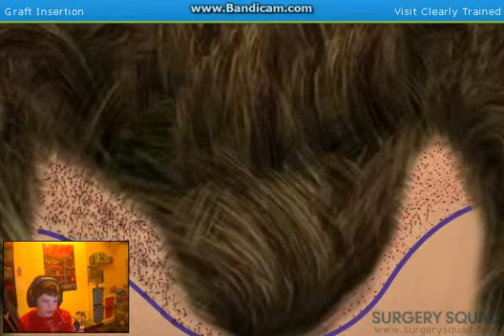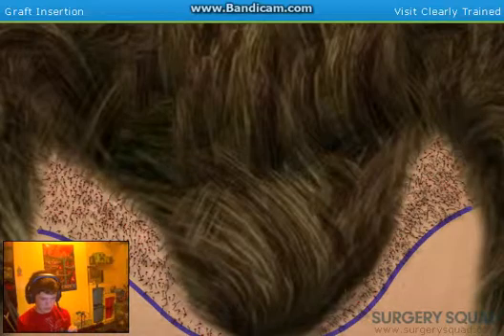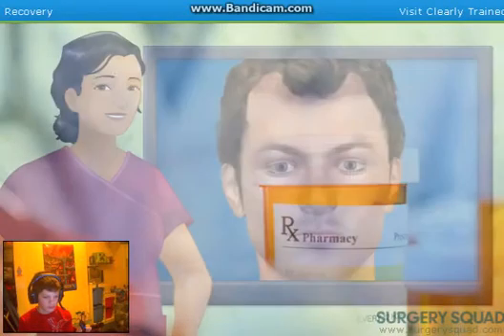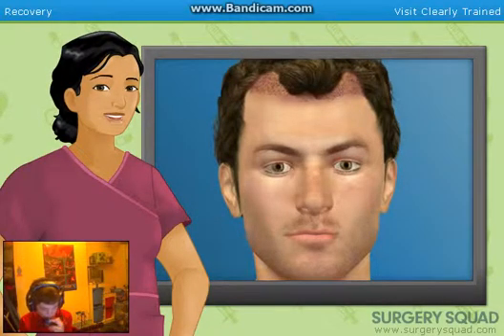You're a natural. Now that you've got the hang of it, we'll repeat these steps for the remainder of the recipient site. After the procedure has been completed, our patient will be prescribed antibiotics to prevent wound or graft infections. For up to a week after the procedure, the donor area may be sore and some numbness may be experienced as well. Our patient can also expect moderate swelling and redness during this time.